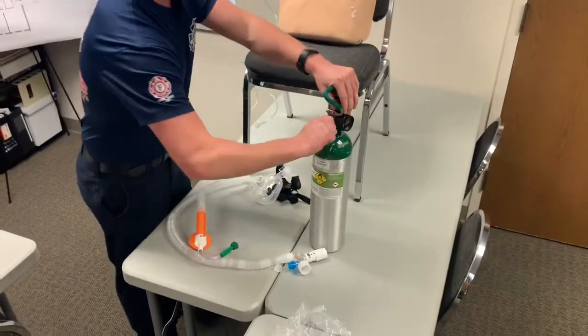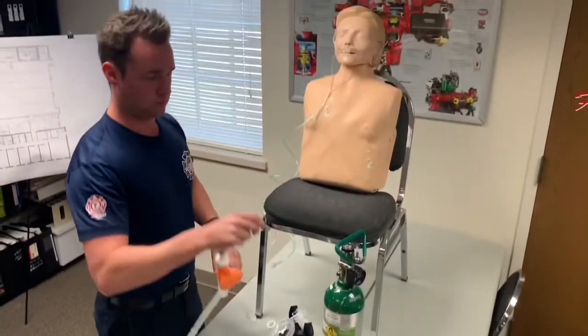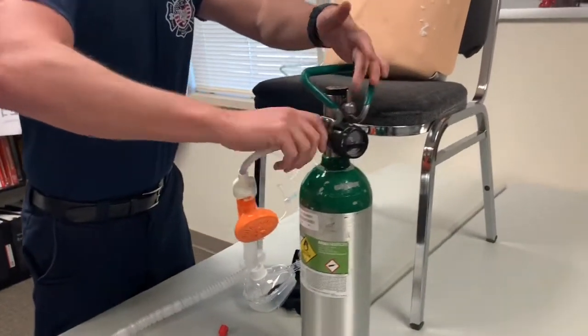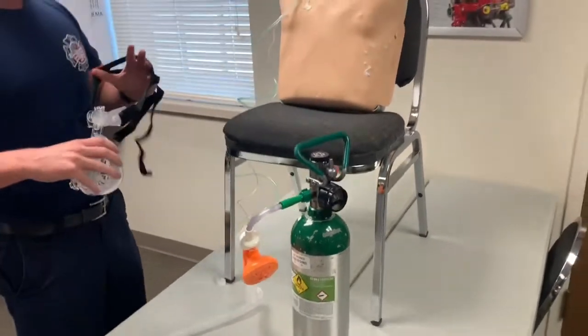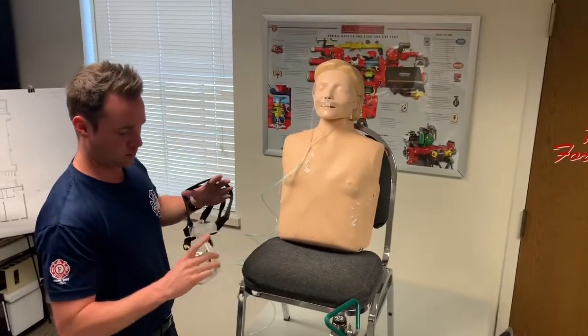So for the portable oxygen bottle, we connect right here. It just screws on, and we set it to 25 liters a minute. And we're going to apply the mask to the patient's face. You're obviously going to want to be talking them through it.